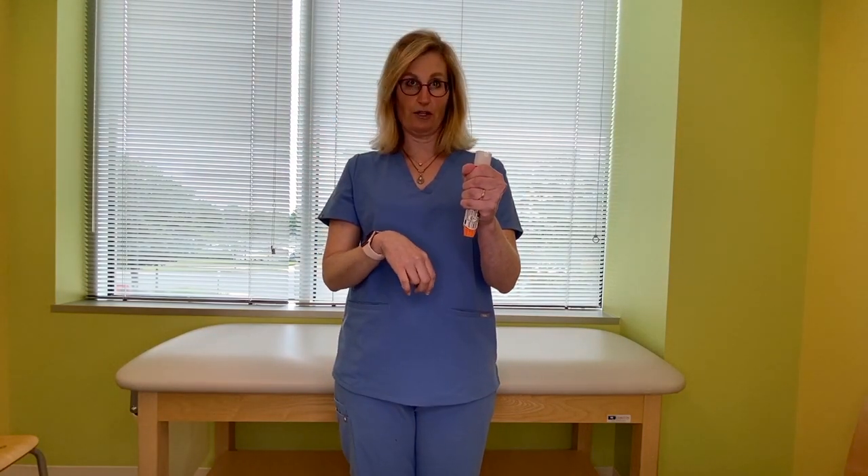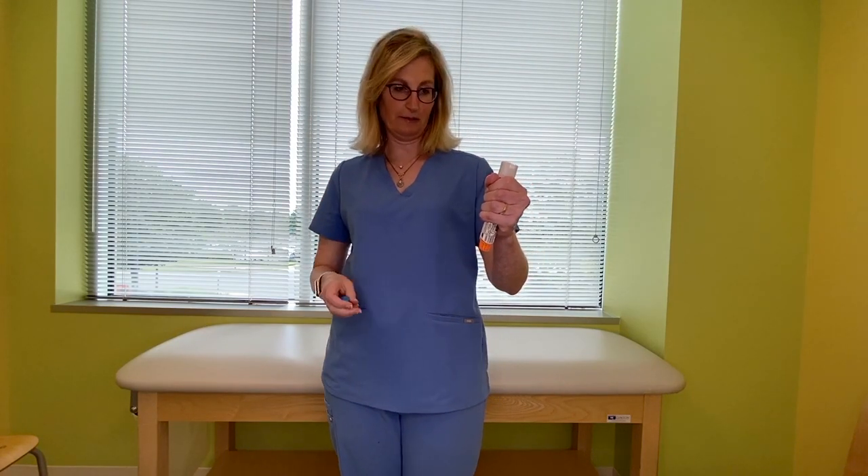The blue safety cap comes off. Let's say you're ready to use it — you take the blue safety cap off. Now it's ready to go. This orange part is going to go into your thigh. You want to put it into the quadricep, which is one of the largest muscles in your body. That helps get the medicine back to your heart as quickly as possible.